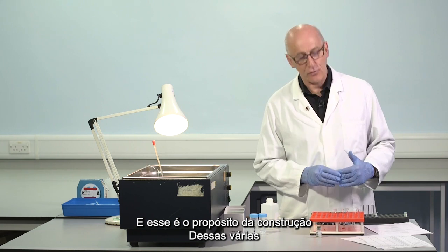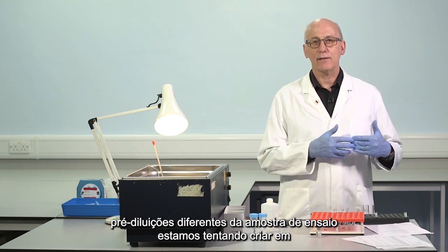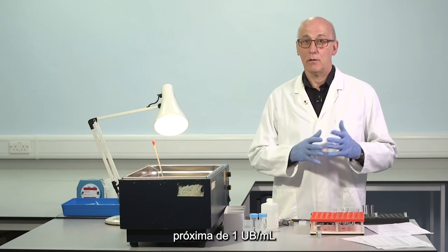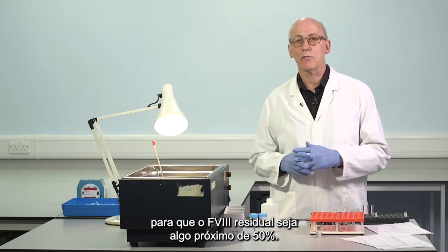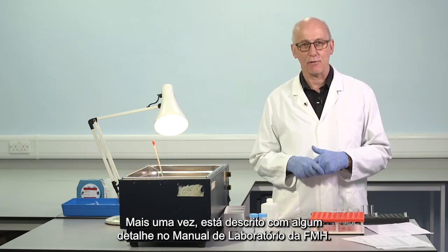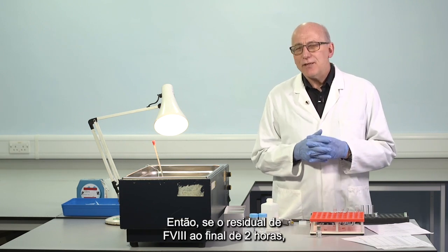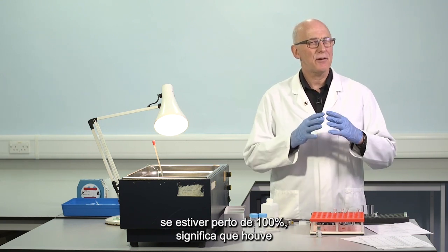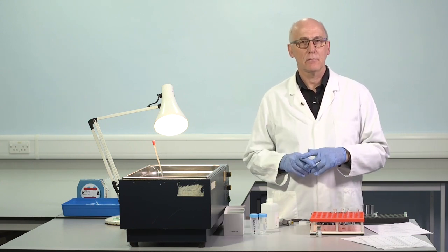And that's the purpose of constructing these several different pre-dilutions of the test sample. We're trying to create in one of those pre-dilutions an inhibitor concentration somewhere close to 1 Bethesda unit per mil, so that the residual factor 8 will be somewhere close to 50%. You'll see when we make the plot how we fully quantitate the assay. And again, it's described in some detail in the WFH lab manual. So if the residual factor 8 at the end of 2 hours is close to 100%, it means there has been no additional loss. No antibodies present. 100% residual, 0 inhibitor.